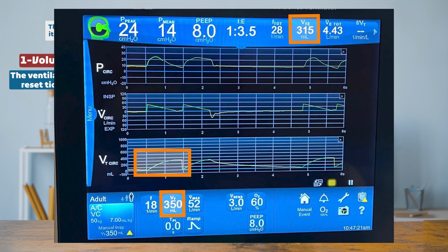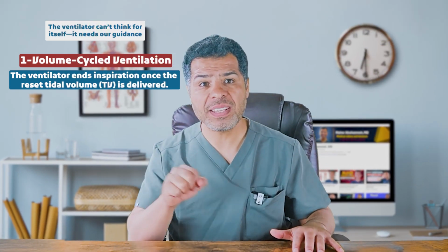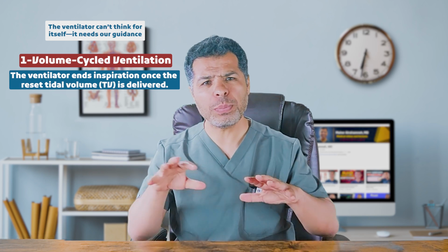Look at the ventilator screen and see the volume versus time curve. Once it reaches the desired tidal volume, it will switch from the green color, which represents inspiration, to the yellow color, which represents expiration. Also look at the top panel and see that the actual tidal volume was 315, not the set tidal volume. In reality, the ventilator doesn't always fulfill the exact set tidal volume, but it will be close to that.